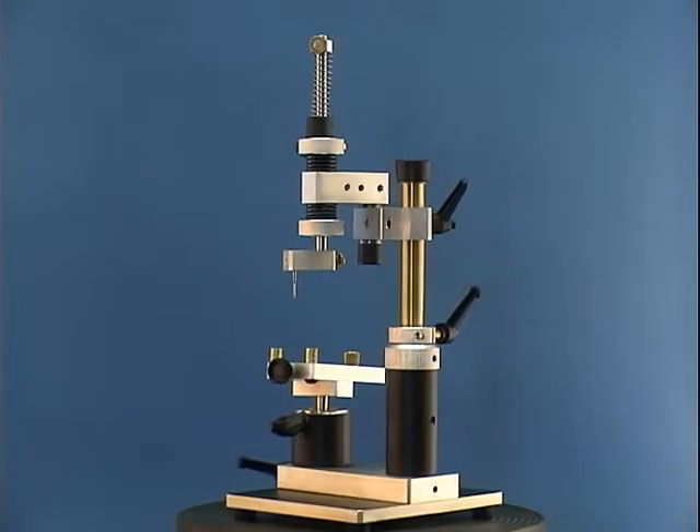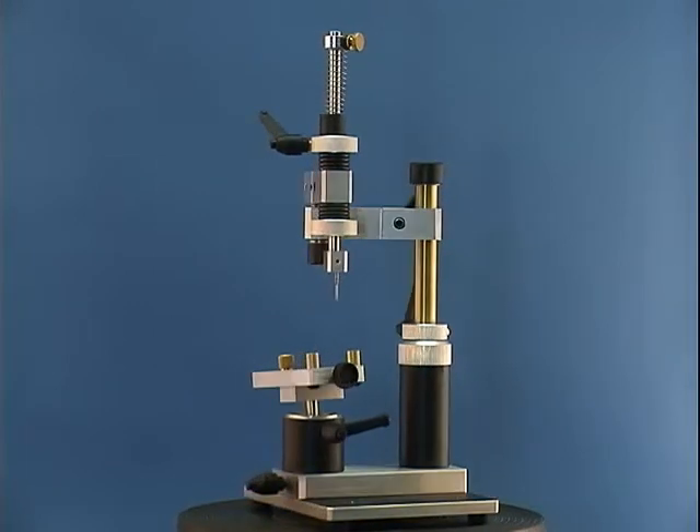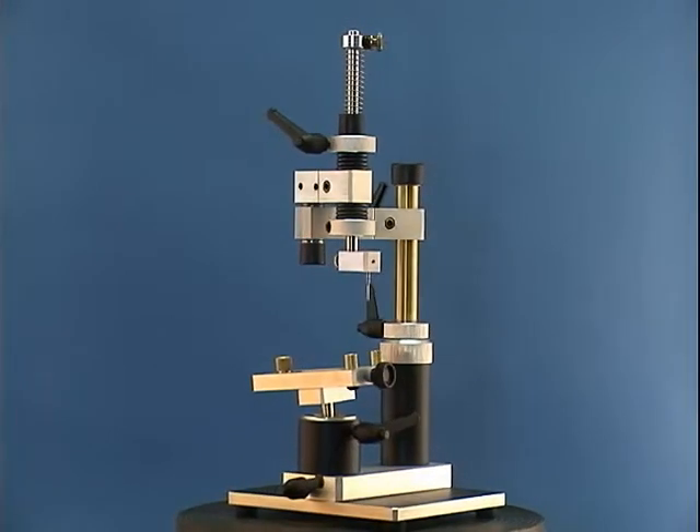The model tilt platform is the same one used on our MX series. To see a video of its features, visit our video page.